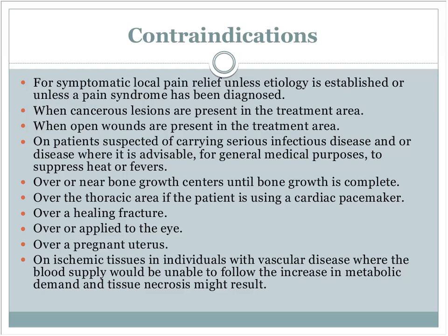Infectious diseases, same type of thing. You can spread it. This gets really important when it comes to cross-contamination. Even if a patient does not have any diagnosed illness, whenever I'm done with the ultrasound, I clean off the sound head with a towel, and then I wipe it off with an alcohol wipe, and then not wipe that off. I will let it air dry so that it has contact time.